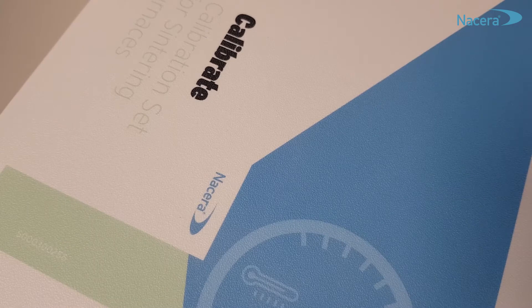Hello and welcome to Doceram Medical Ceramics in Dortmund. My name is Alexia Gaussmann and I will show you today the correct use of the Nacera Calibrate set for sintering furnaces.